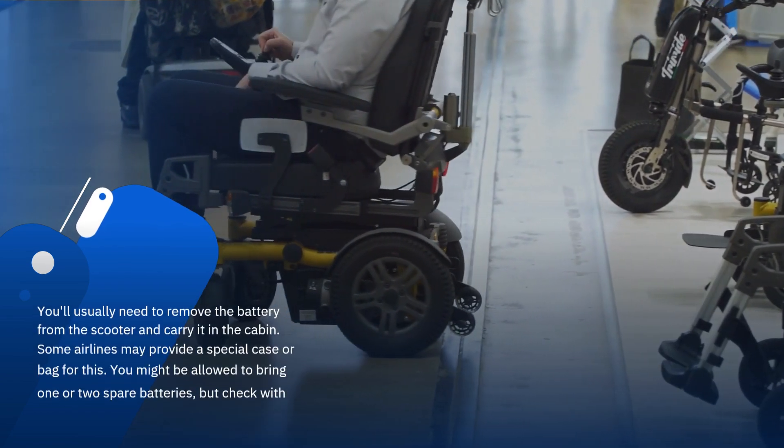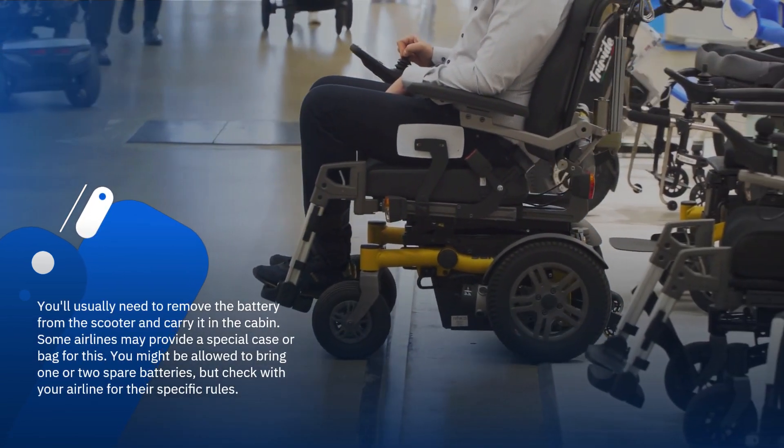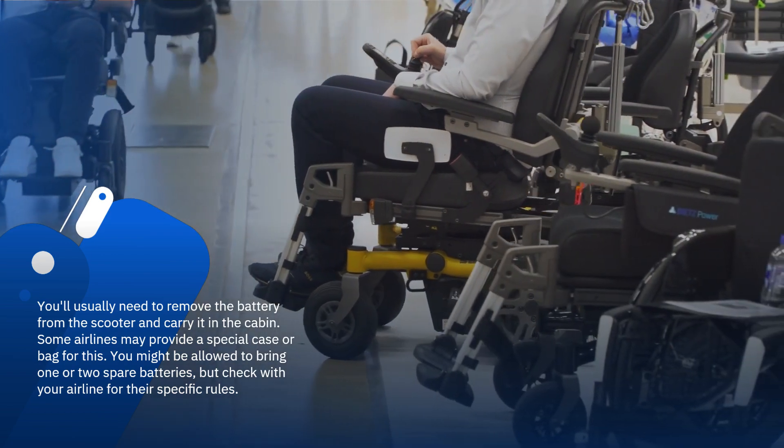You'll usually need to remove the battery from the scooter and carry it in the cabin. Some airlines may provide a special case or bag for this.